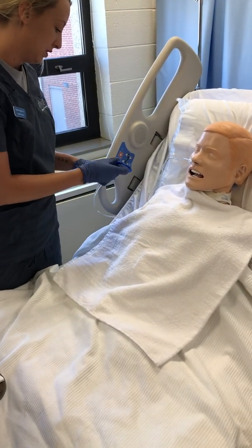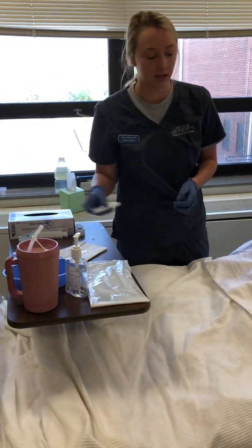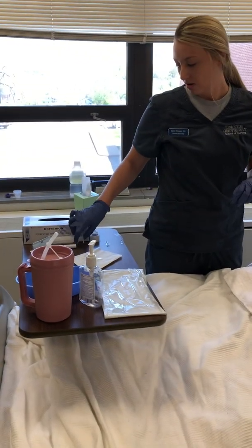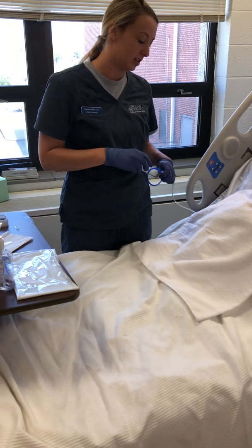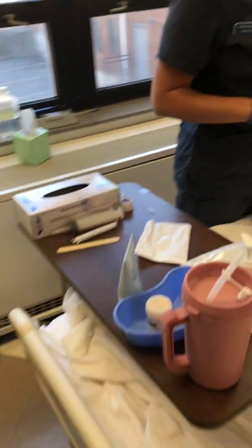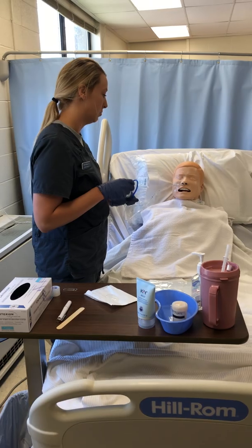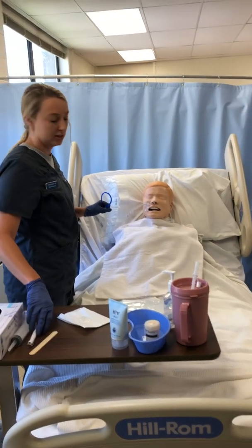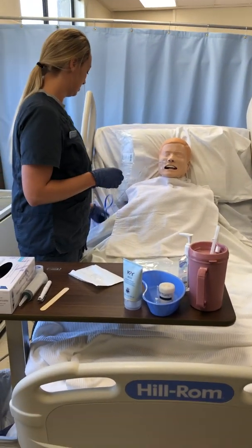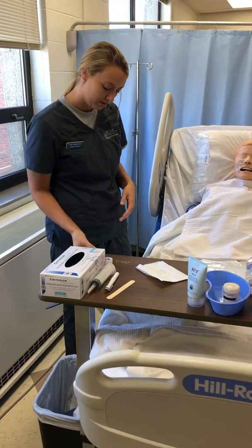And then once you have it temporarily, you can test to where it's at. You can look in to make sure that it's not coiled up in the back of their throat. You can get some residual out and test the pH on pH paper, or I can insert air into this and then listen over the epigastric for air bubbles. Or lastly, you can get an x-ray to check the placement. And once you check to where it's at, that's when you would tape it securely on them.